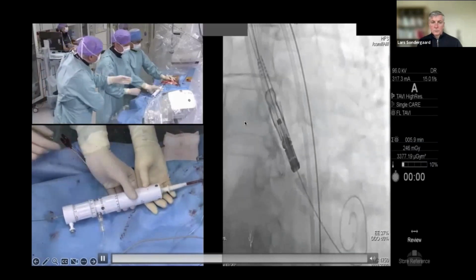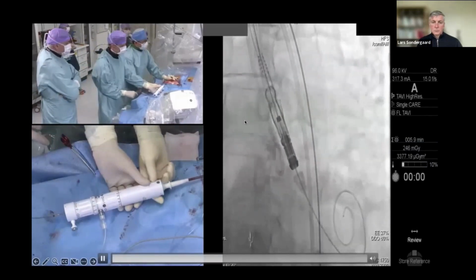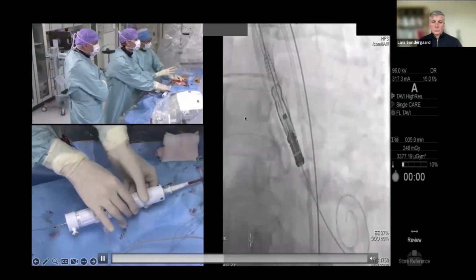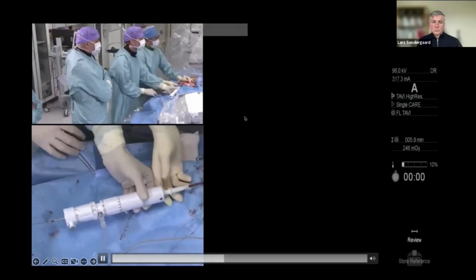If you're not close, what are you going to do? Just demonstrate on the handle. So once we come a bit lower down, we would rotate the handle, and depending on how much we need to turn, it can sometimes be even a full turn.